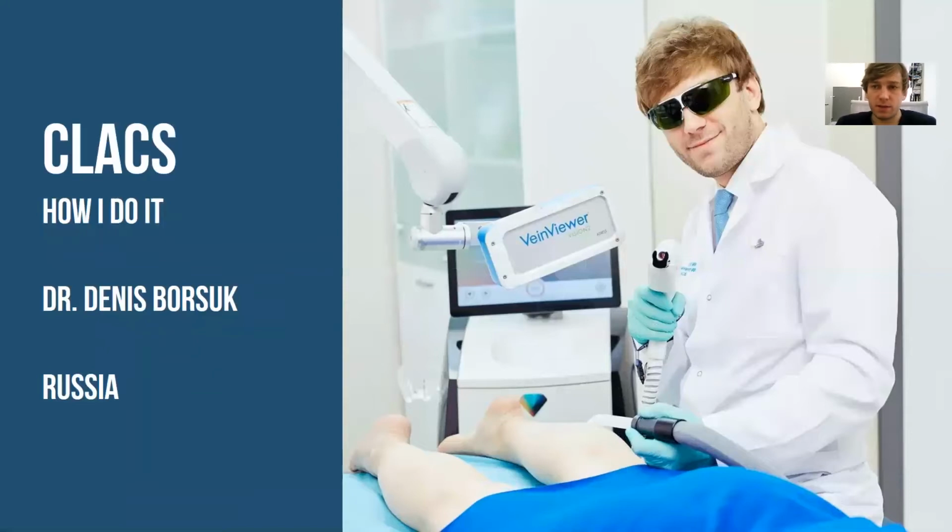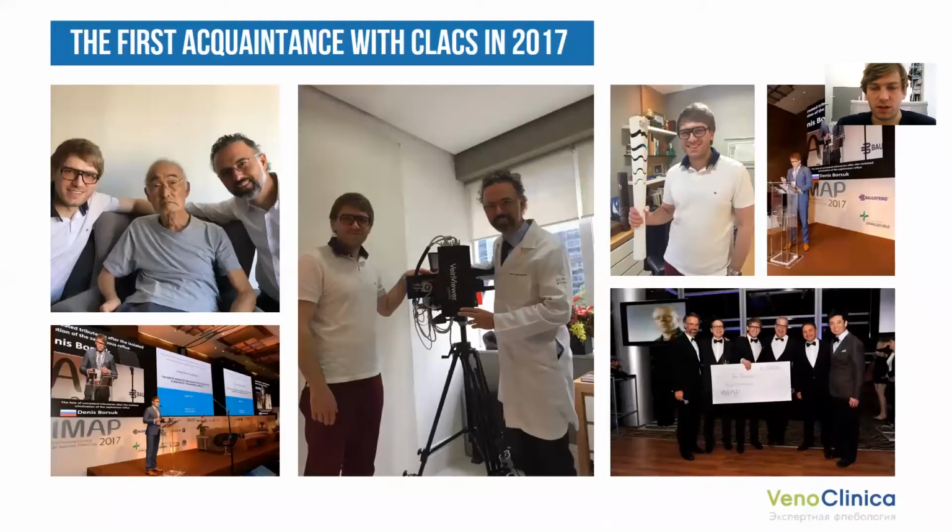Dear colleagues, my name is Denis Borsuk, and in this short video I will show you how we do the CLaCS procedure, cryo-laser cryosclerotherapy. Our first acquaintance with the CLaCS method was in 2017.